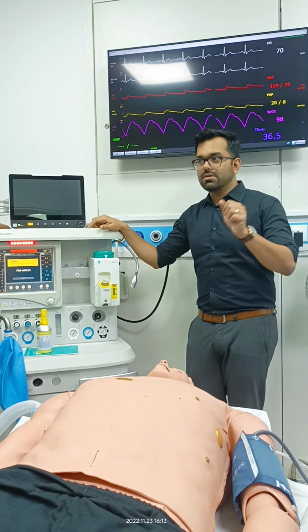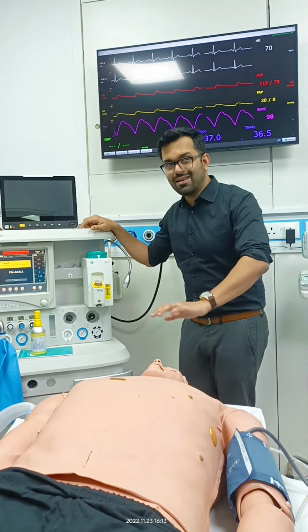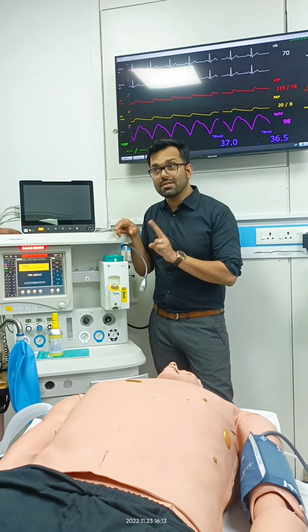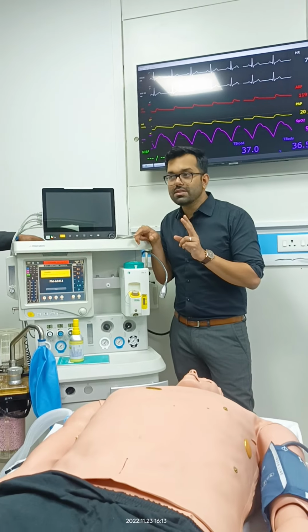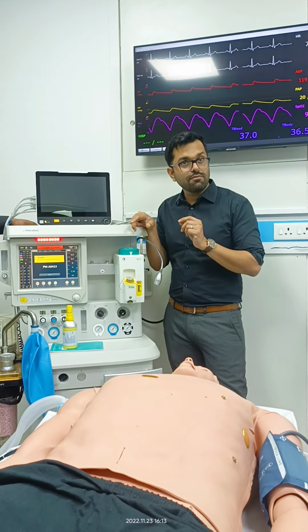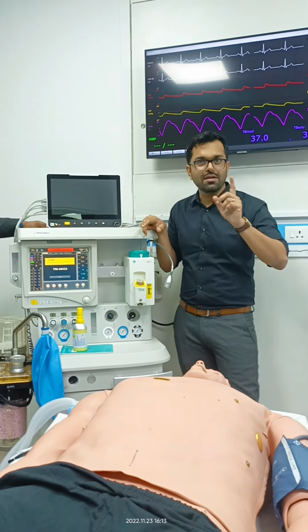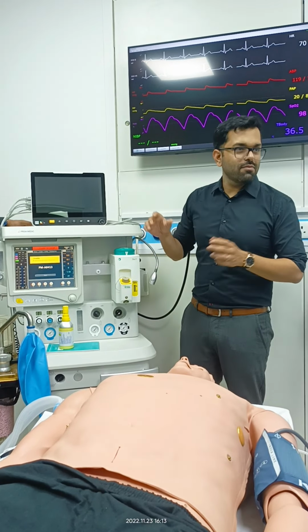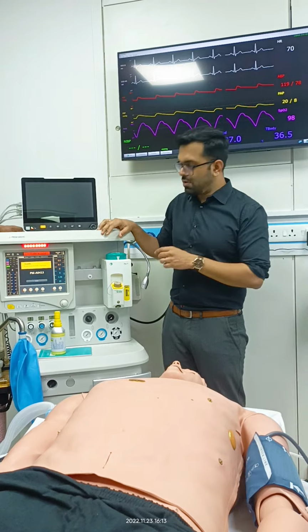That is the concentration that you need to maintain the level of anesthesia in general anesthesia. For sevoflurane, it is around 2%. For isoflurane, 1.1, 1.2%. For desflurane, I think 6 or 7%. 6%. So depending upon the agent. It's been long, I've used desflurane long ago.